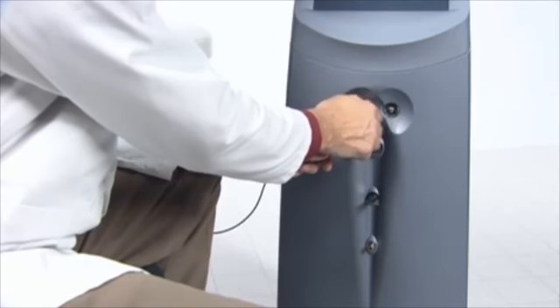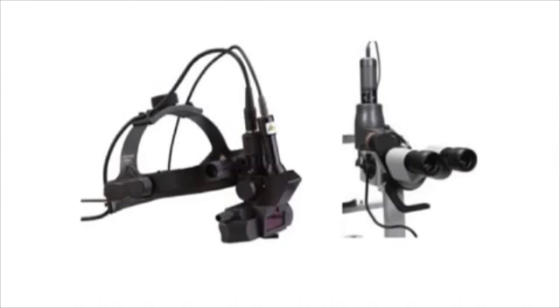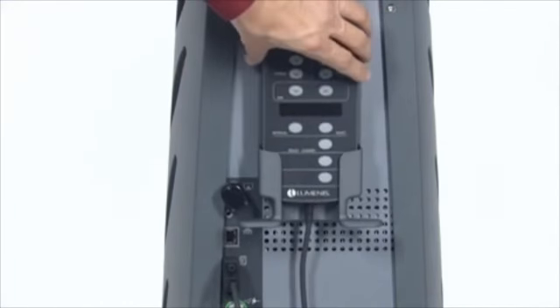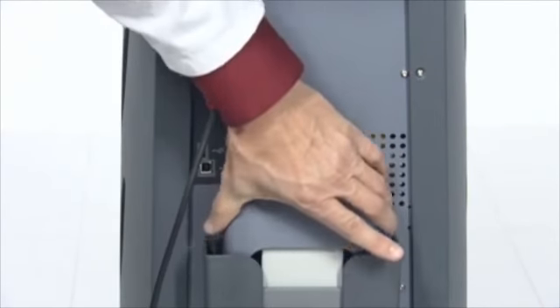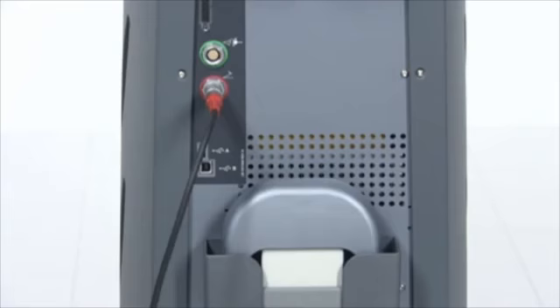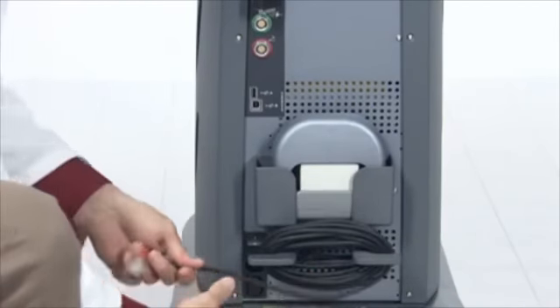Disconnect the delivery devices from the laser. If the delivery device is single use, dispose of it properly. Otherwise, inspect and clean the delivery devices as instructed in the appropriate delivery device operator manuals. Store the remote control under the handle on the rear of the laser console. Remove the foot switch plug from the laser. Place the foot switch into the foot switch storage mount on the rear of the laser console. Wrap the foot switch cable around the foot switch storage mount.